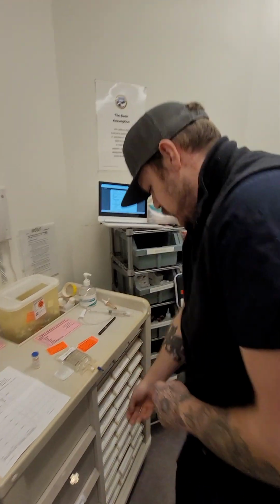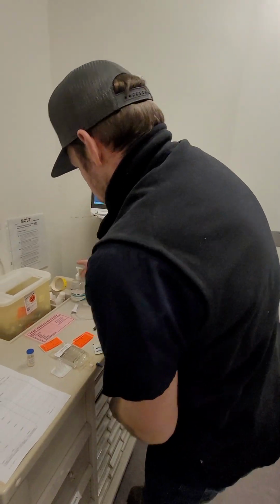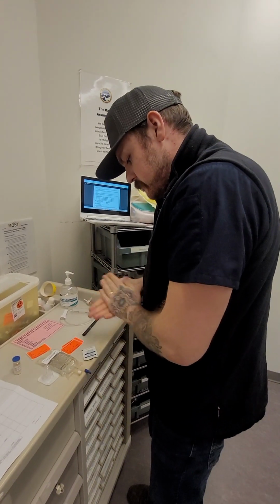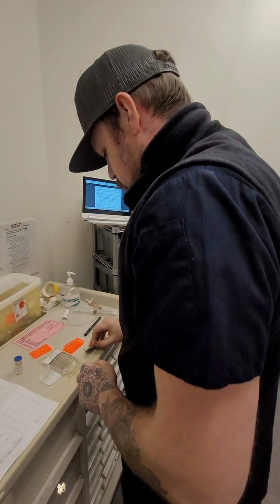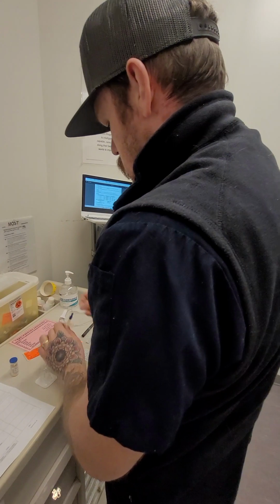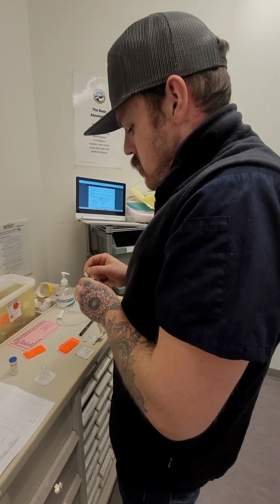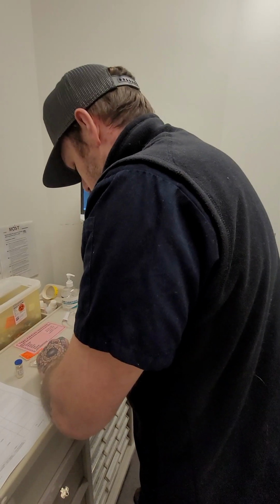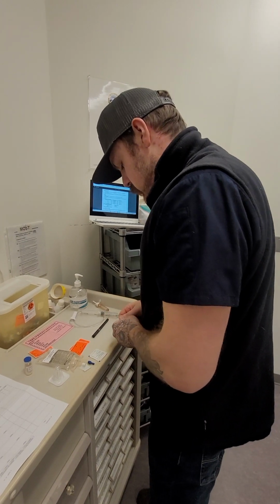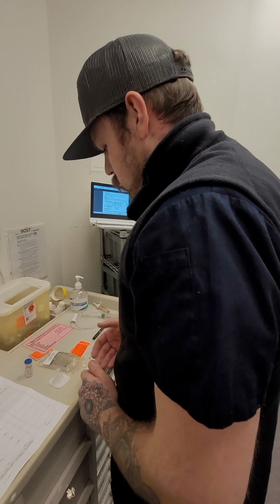So first things first, I'm going to need some alcohol swabs. I'm going to give my hands another sanitize here. And I'm going to go ahead and sanitize this. Perfect. Now I'm going to let that dry for 15 to 30 seconds. I've got it on this alcohol swab, so we know that it's good.